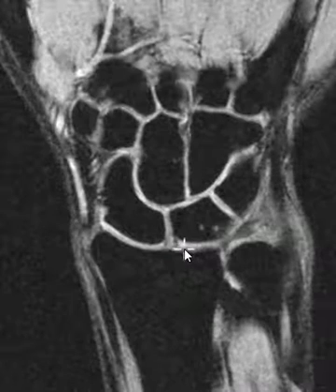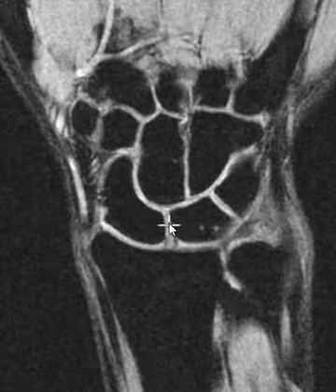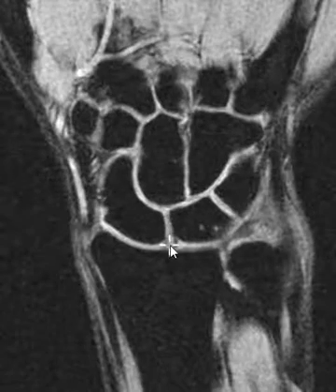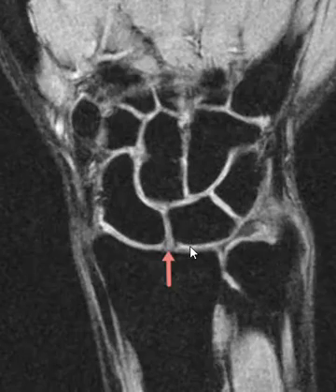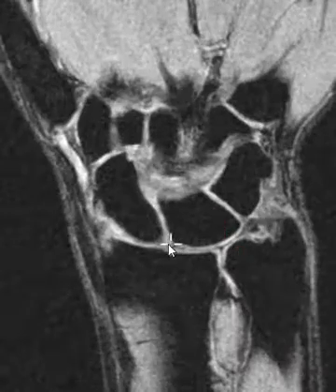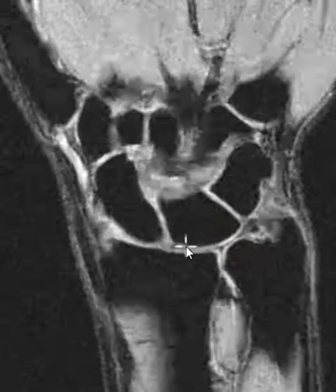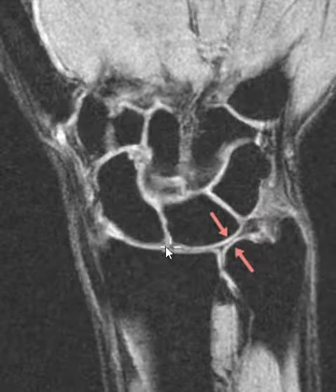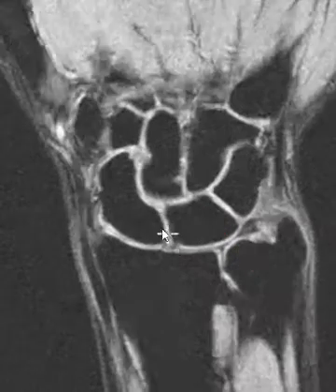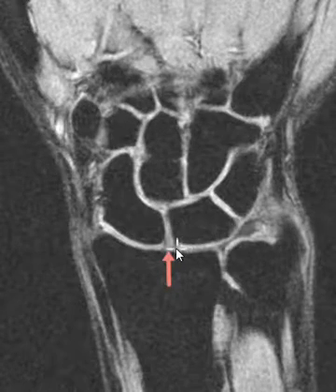Normally, over time, this can widen, and you'll sometimes see it just from a widened scapholunate interspace. But in this patient it's not widened yet. There may be a little component along the palmar margin — there's a dorsal component and a palmar component there.